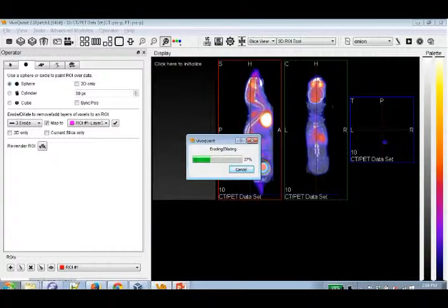That's the same. So, and you can see them. This is why it's like a remote control, because I can sit here and all the operations are still happening in VivoQuant, and I can still monitor them and make sure that they're working properly, but I don't have to intervene.